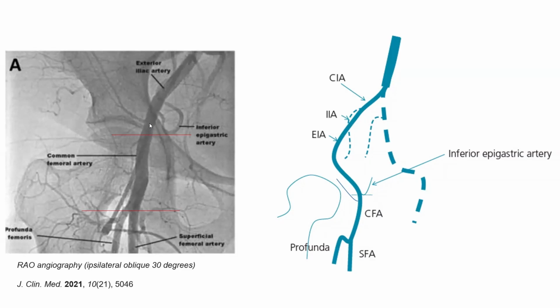Now, 2D angiography is deceiving, and I want you to understand why that separation between femoral and iliac is so important. If you look from the side laterally, you will see that immediately upon that inferior epigastric artery, the artery, which is an iliac artery, takes a very deep and sharp dive into the pelvis.